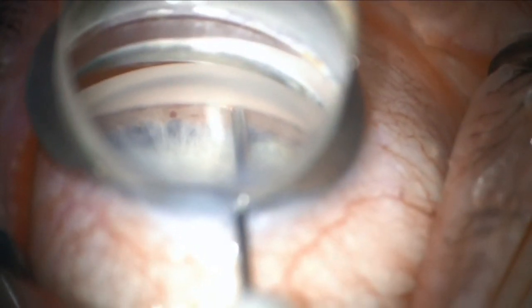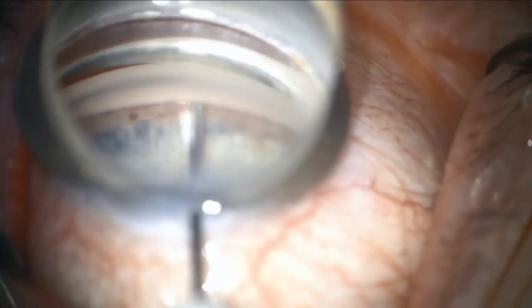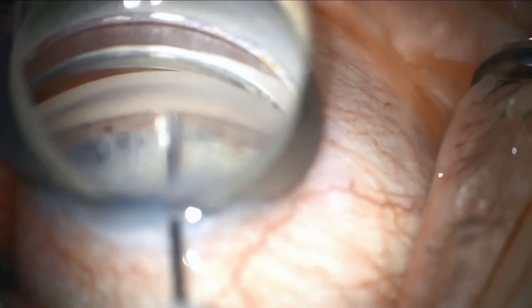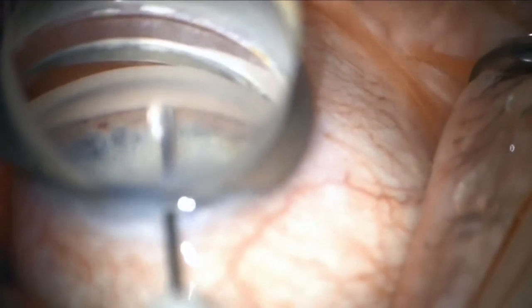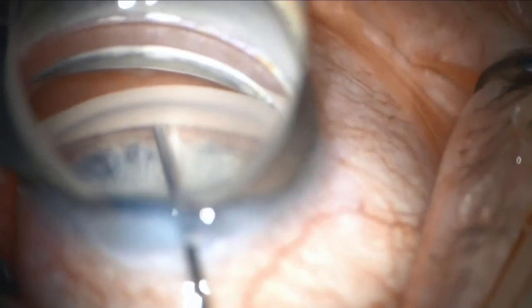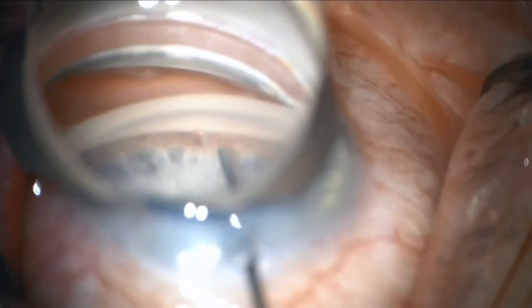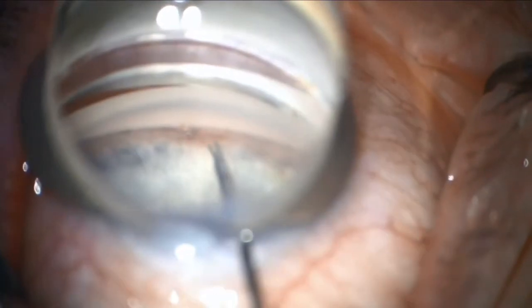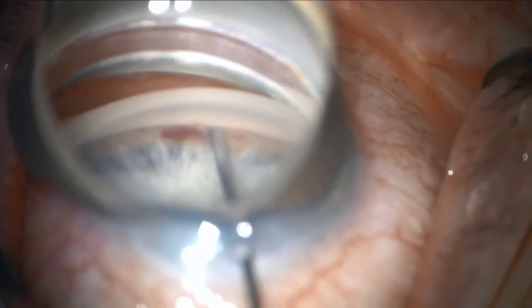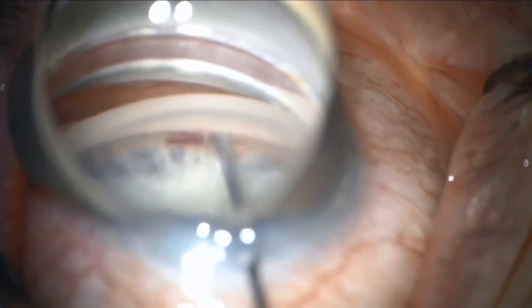We tilt the eye stent about 15 degrees to engage the trabecular meshwork, and then we slide across, inserting the eye stent into Schlem's canal. And then we release — there's a little button on the eye stent injector that we release. There's a little bit of heme there, which is normal.